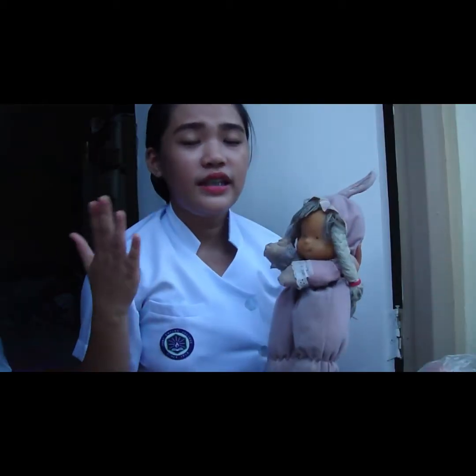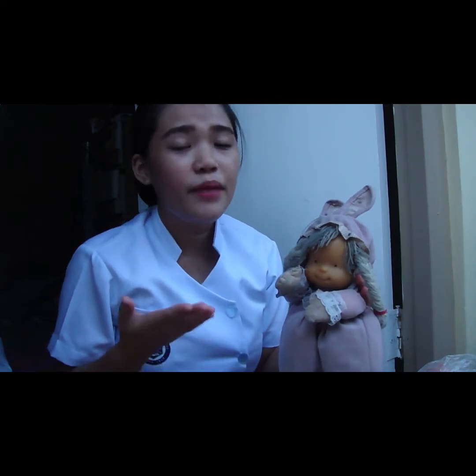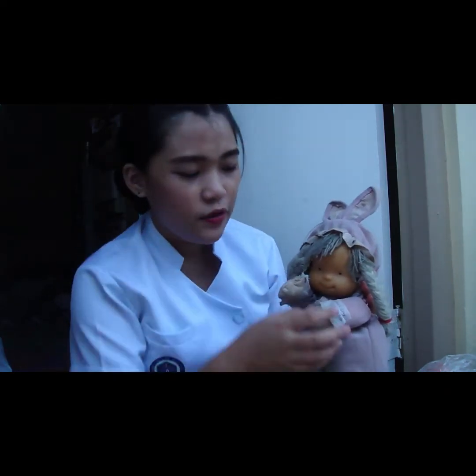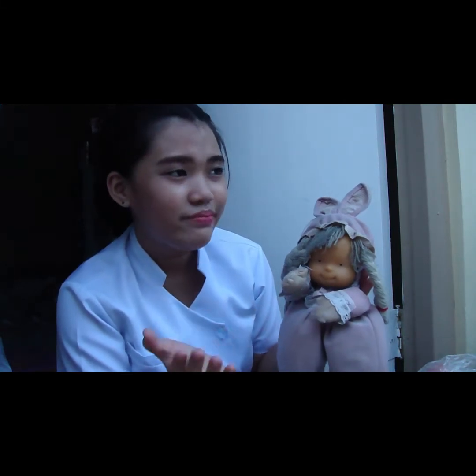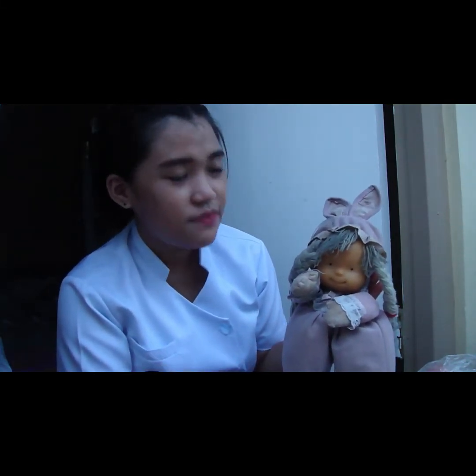So the next thing that we're gonna do is we will explain to the client that the medication will produce a small wheal, or sometimes called a bleb. So magkakaroon lang po ng small na bilog sa inyong arm na may pagkasakit, pero kailangan po namin gawin for the skin test.